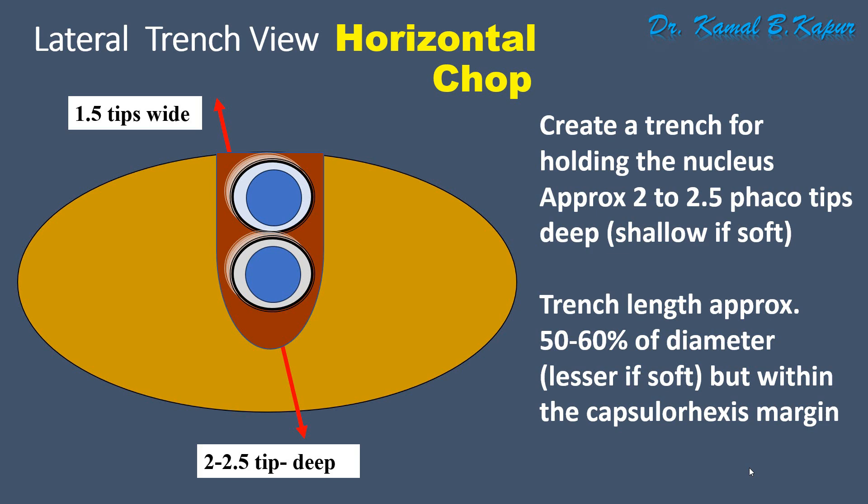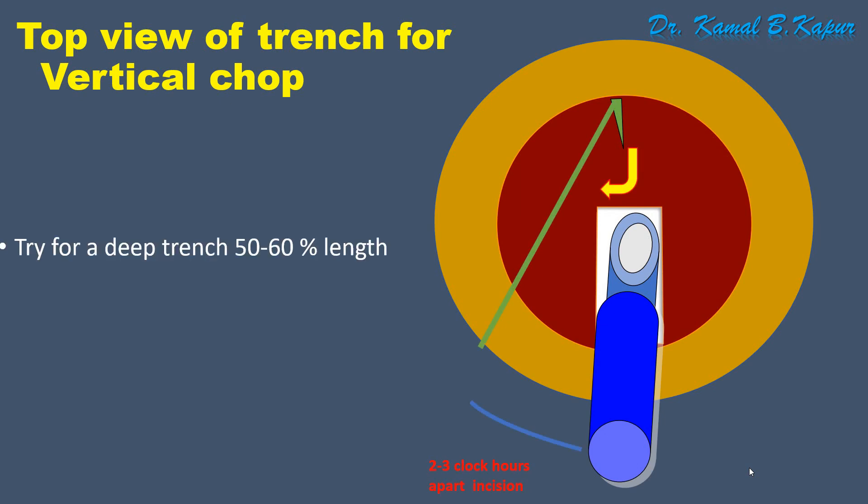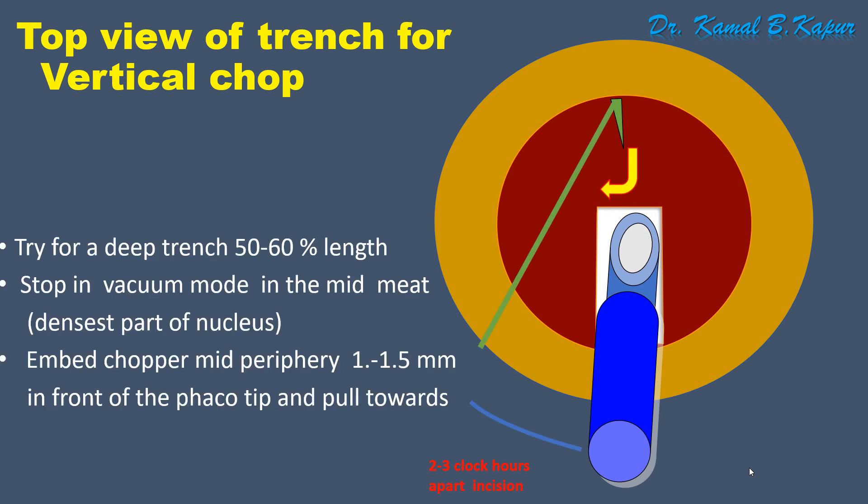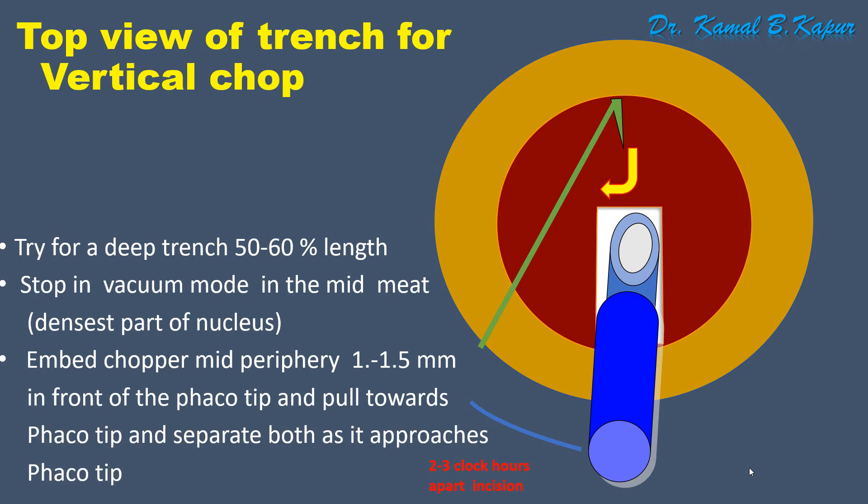The length of the trench should be approximately 50 to 60% of the nucleus, slightly longer than a vertical chop. In the overview, you embed with your FACO tip, create a FACO trench 50 to 60% long, then embed the chopper in front of the FACO tip approximately 1.5 millimeters, pull it towards the FACO tip and separate while pulling.